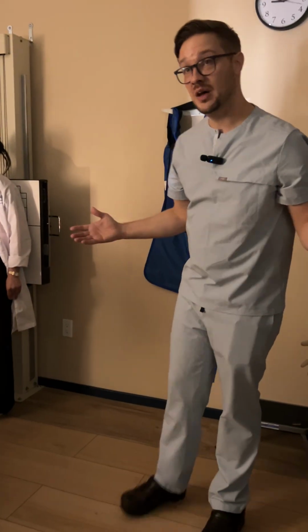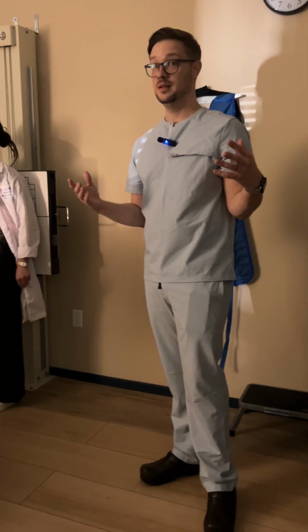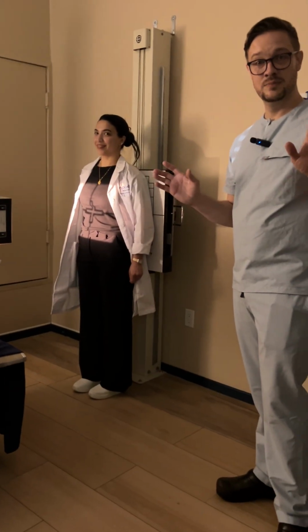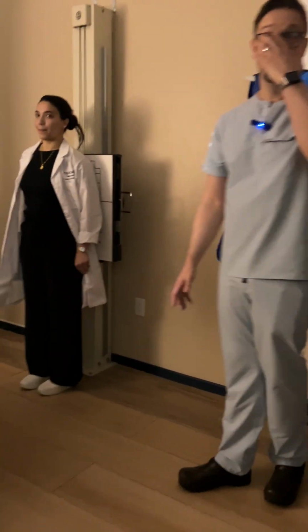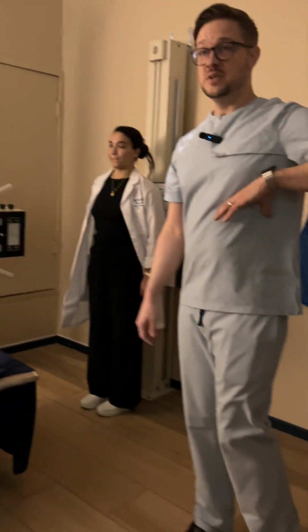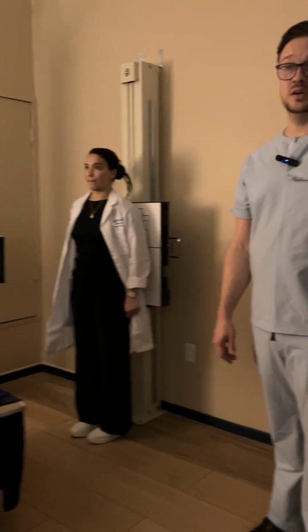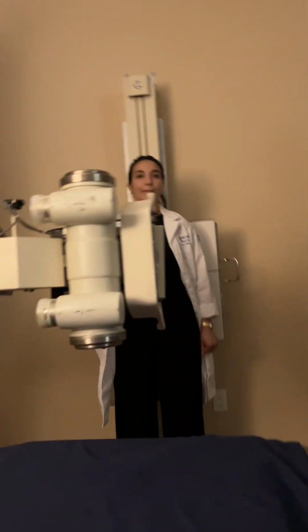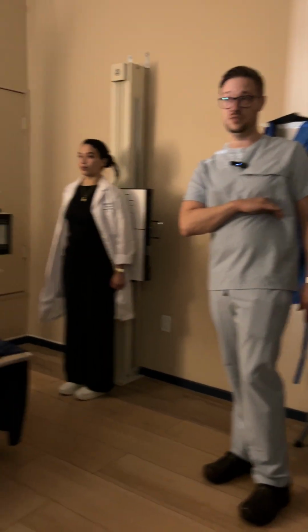Okay? Why do we do an upright abdomen? Why is it important to see the domes of the diaphragms? It's okay if you're wrong. Not pneumonia. That would be a chest thing, right? But we are looking for free air in the abdomen, okay? If we see air under the left hemidiaphragm, it's not abnormal necessarily because we have air in the gastric bubble in the stomach as a normal finding. There's usually a bubble of gas in the stomach or the fundus of the stomach.